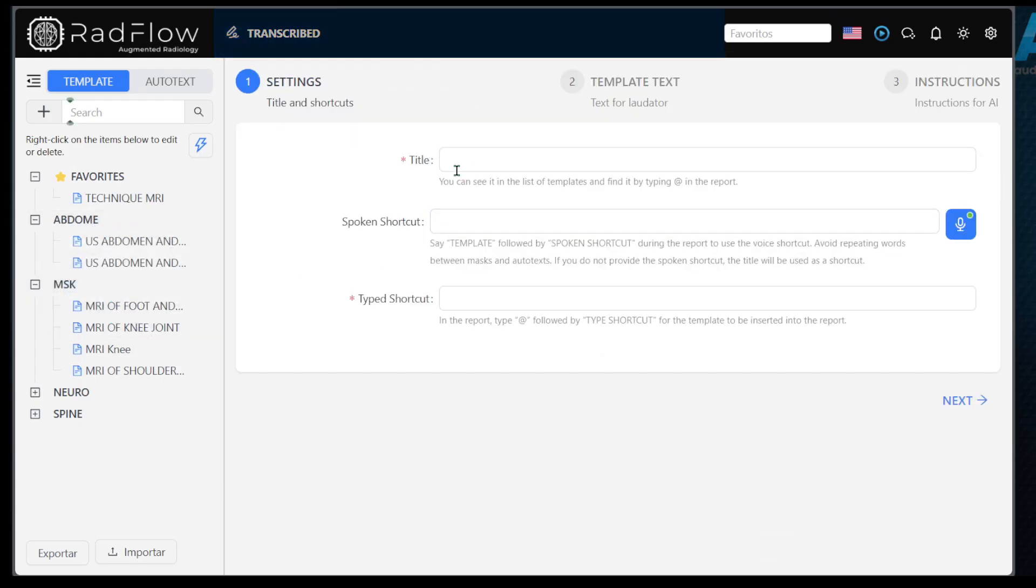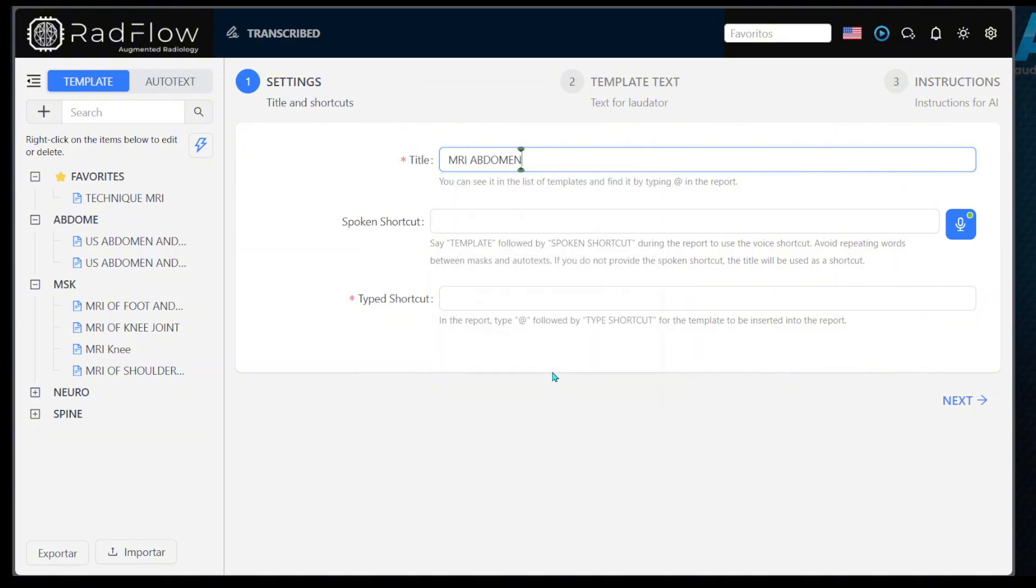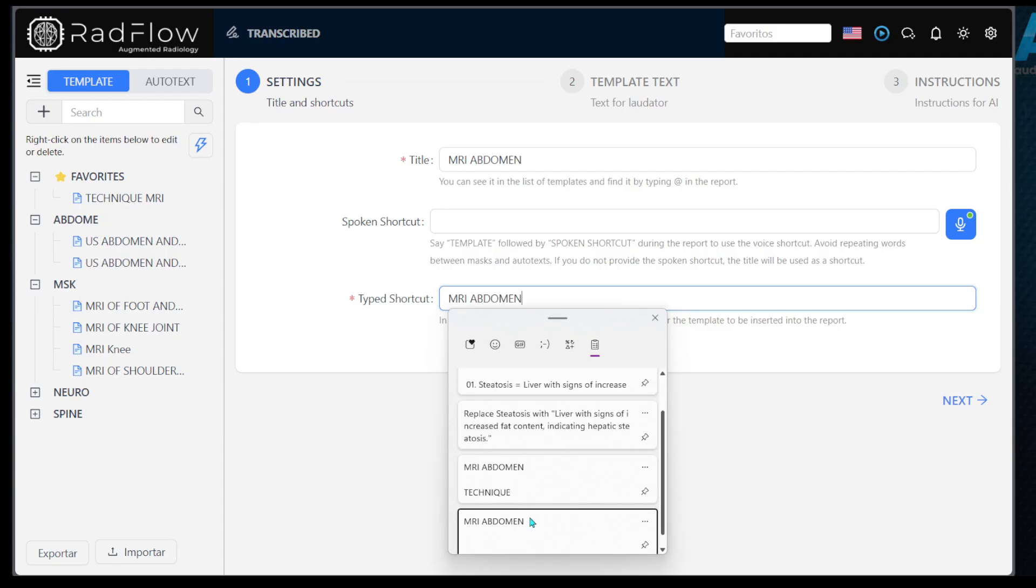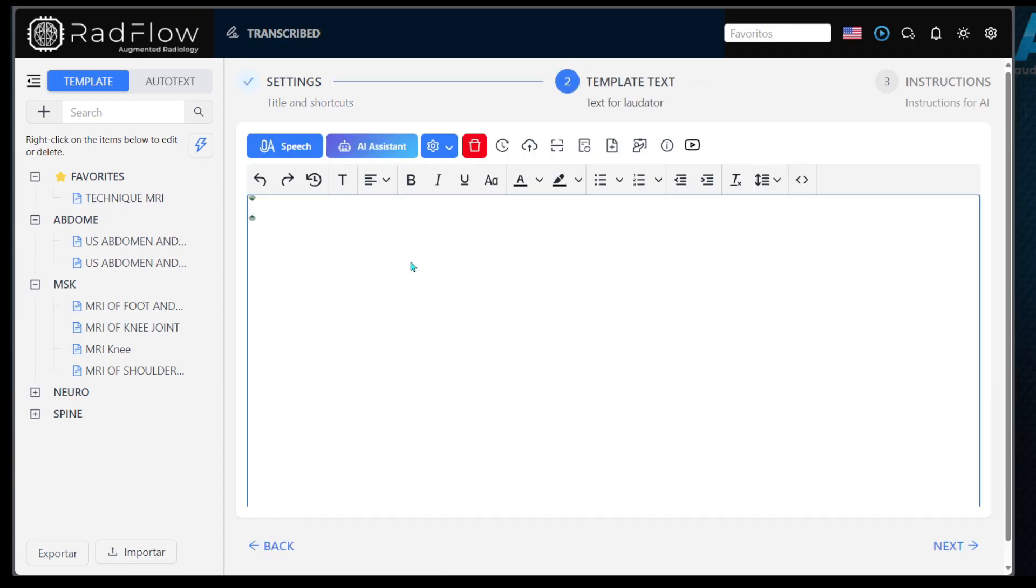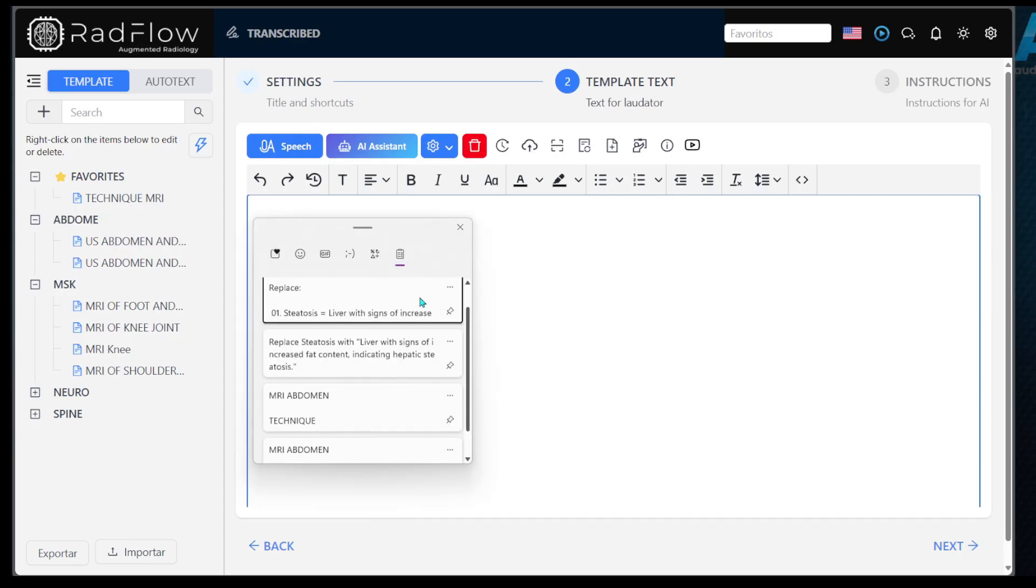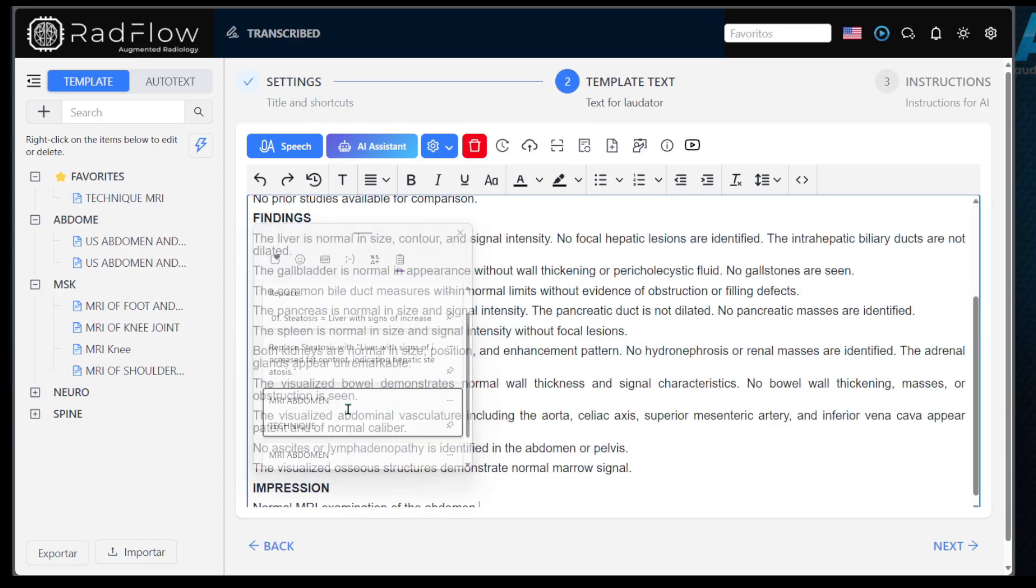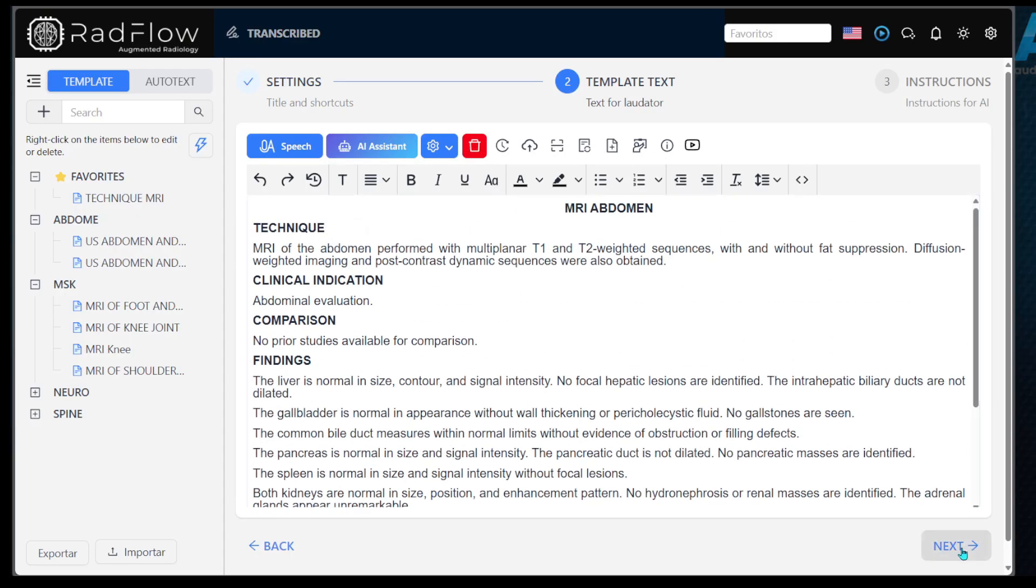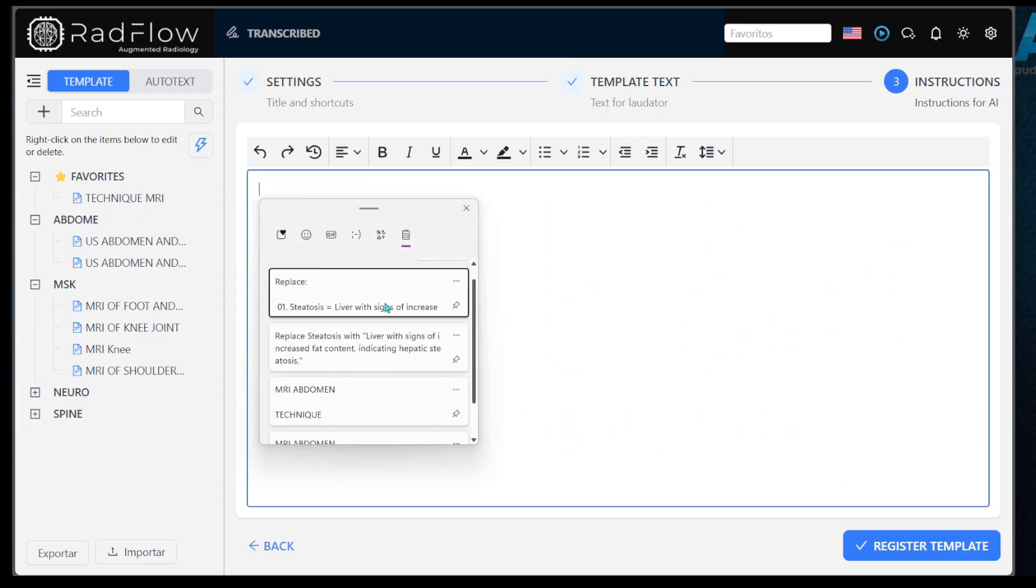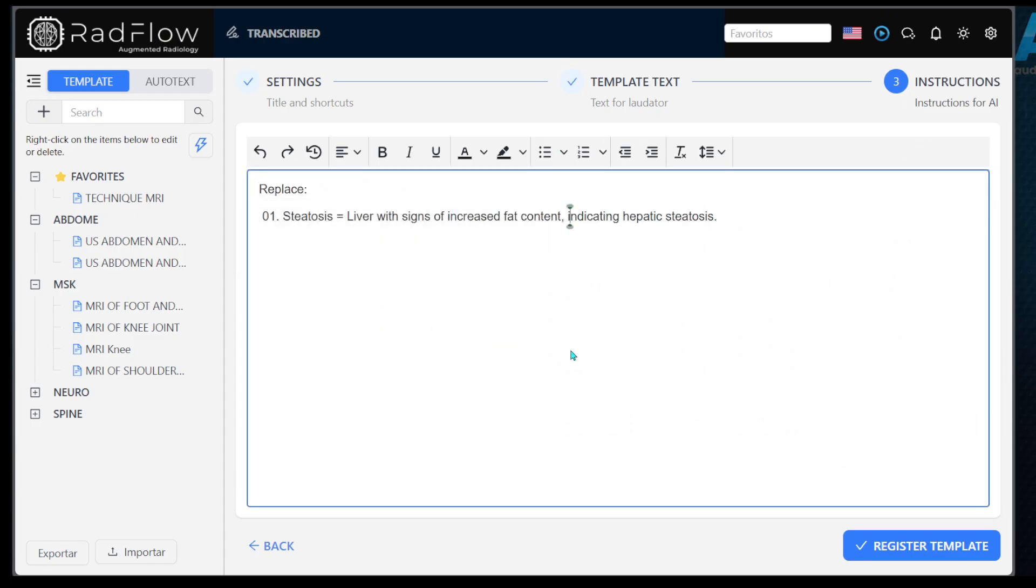There are three steps. One, in the first step, enter the template name and type shortcut, which allows you to load the template using at. Two, in the second step, paste your desired template content. Three, in the third step, you can add command complements or predefined phrases for automatic replacement.